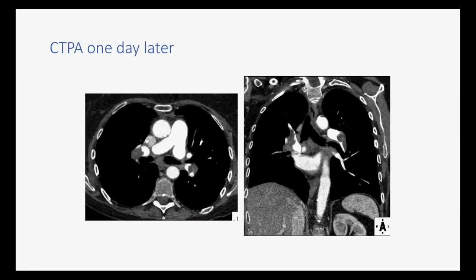This patient had a CTPA one day later. I'm not sure why they got that — I think they weren't 100% convinced that the VQ scan was true. So they went ahead and got a PE study where you can clearly see intraluminal thrombi filling the distal left and distal right pulmonary arteries.